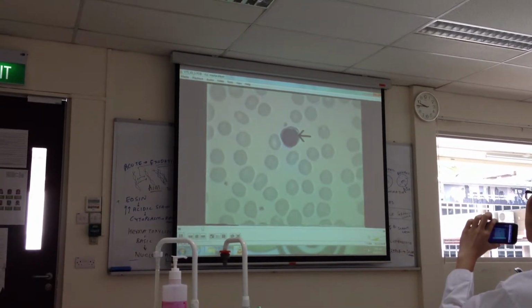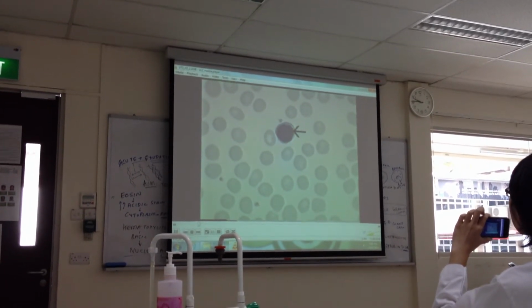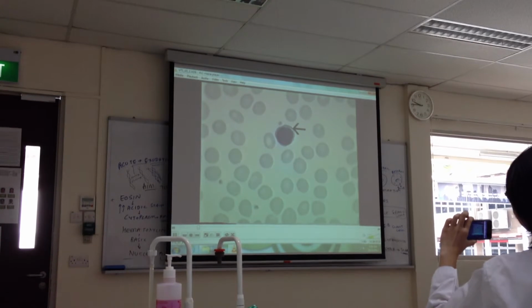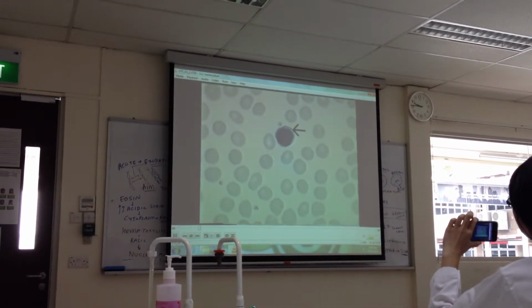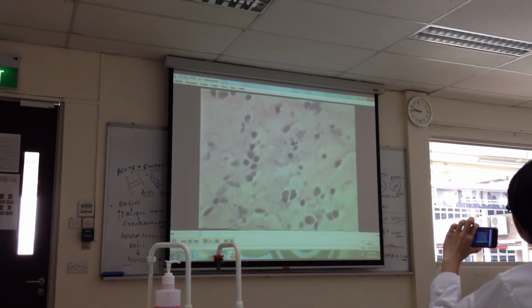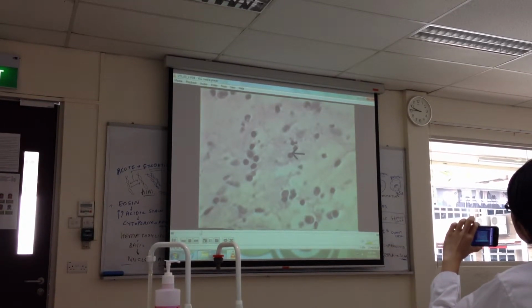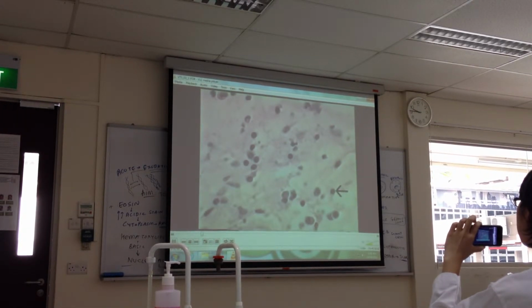This is the nucleus of a lymphocyte. It is round and stains darkly because it has condensed chromatin. This thin film of cytoplasm is all that most lymphocytes have. These cells are also lymphocytes. We can't tell whether they are T lymphocytes or B lymphocytes just by looking at them. This requires special techniques.